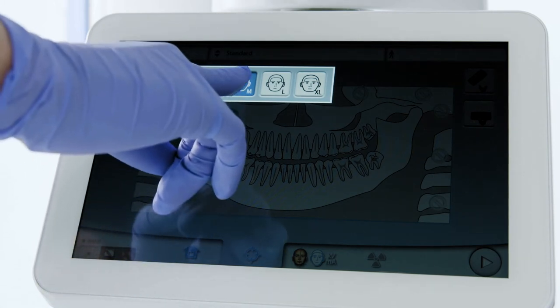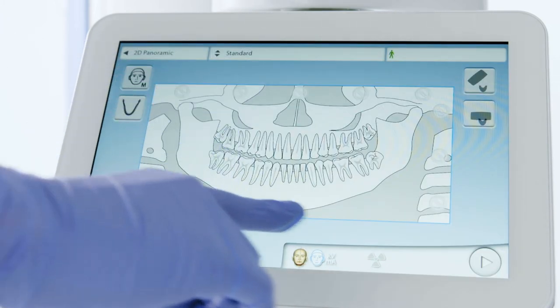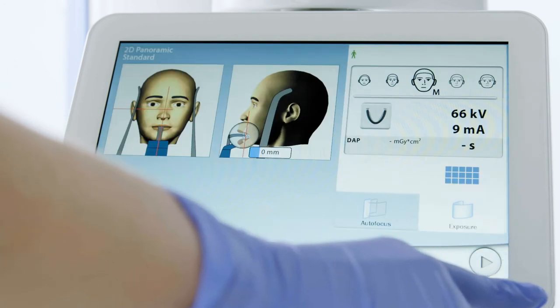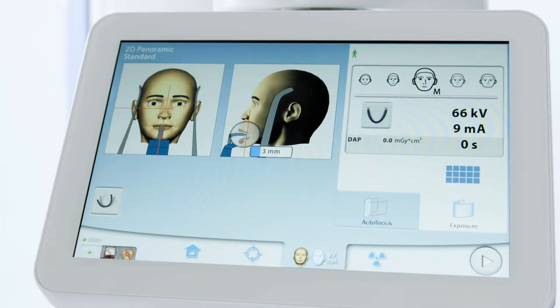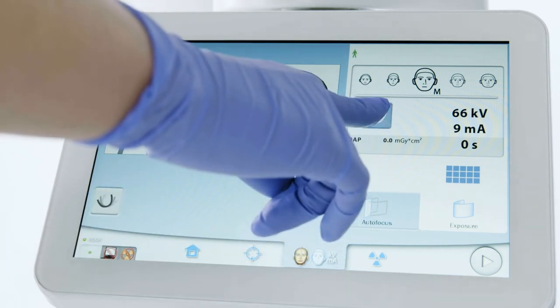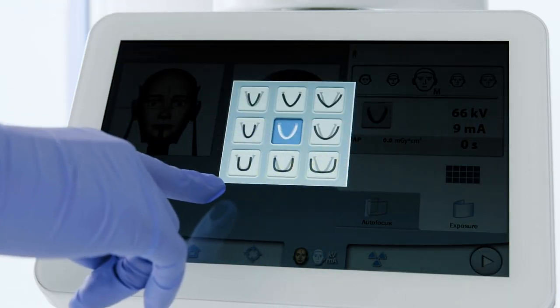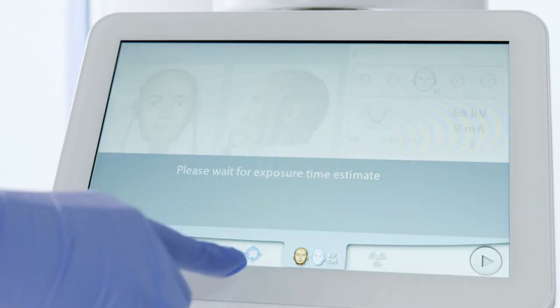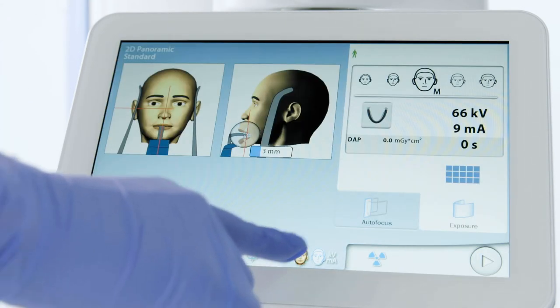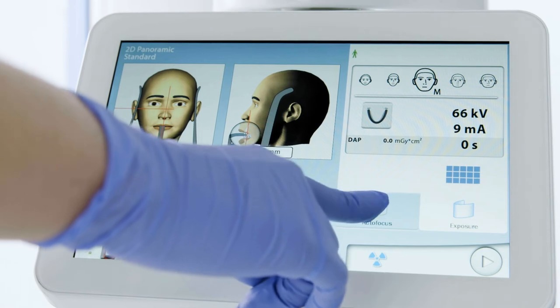If the patient's size is in question, it is better to choose the larger size. Press Forward in the lower right of the touchpad to continue. Evaluate the patient's dentition and select the appropriate maxillary arch shape and size. Select Auto Focus.